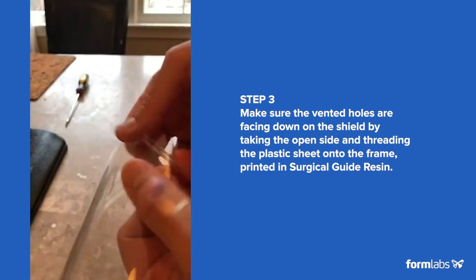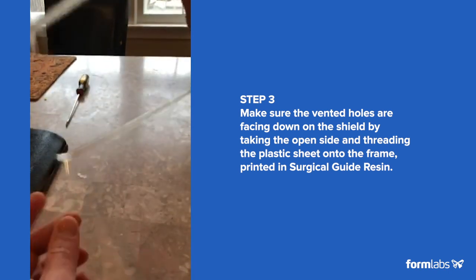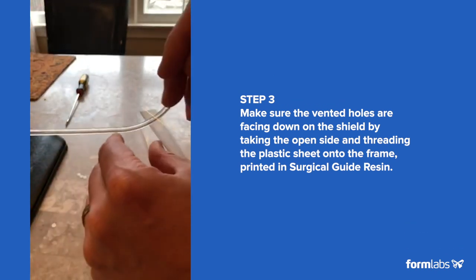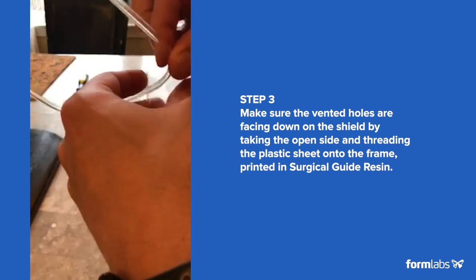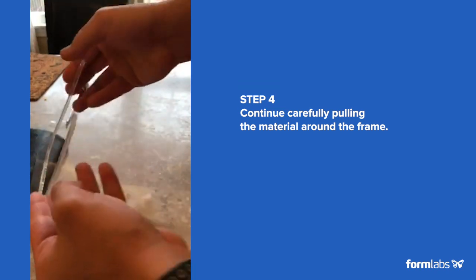And then before you make the turn on this side, you align the other side and bring them to this corner, and then pass through it. You have it in the other corner, then you pull the two sides, and there you go — you have a face shield.